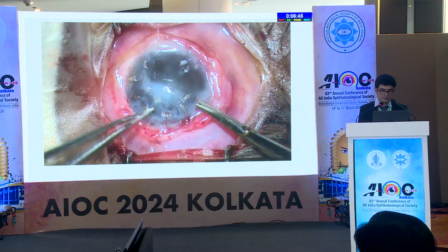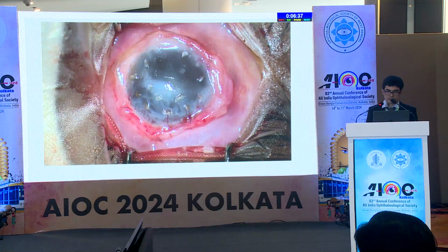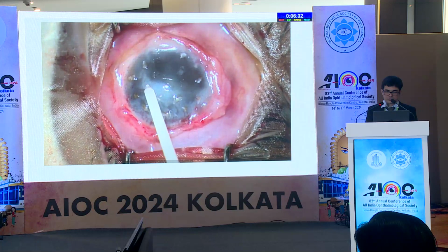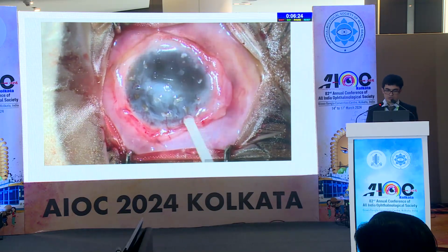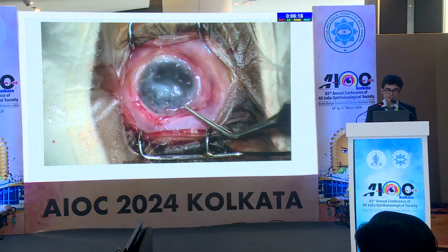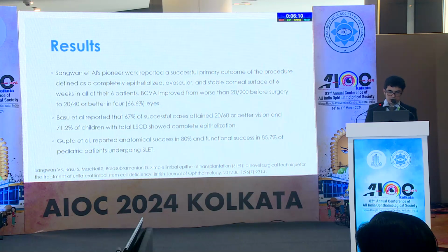So they are placed all around, and fibrin glue is then applied to secure them. And then a bandage contact lens is put. In children, we can even do tarsorrhaphy so that they don't rub the eye. Some other steps I would like to say.